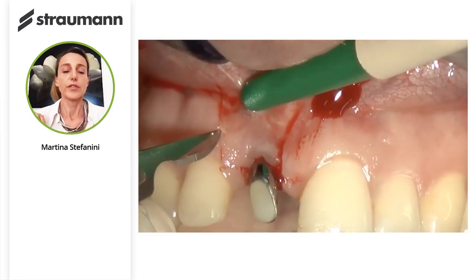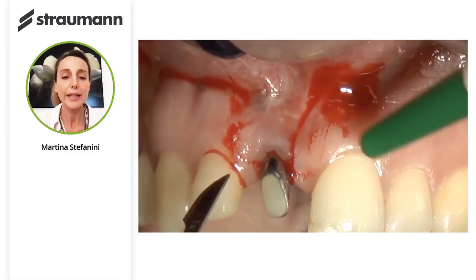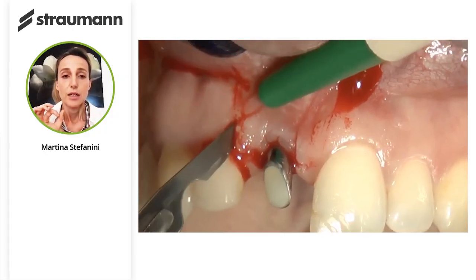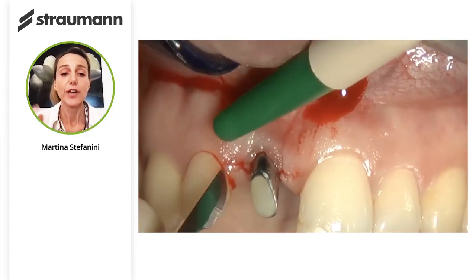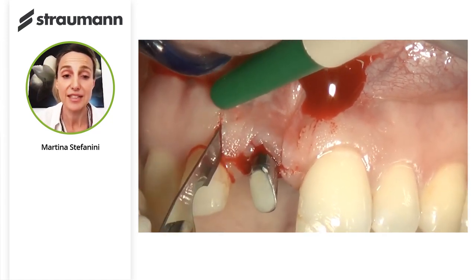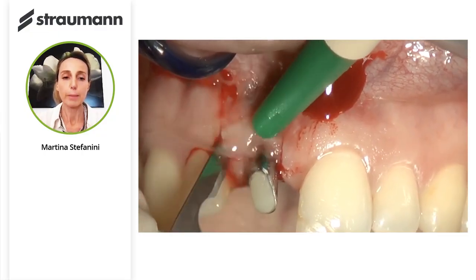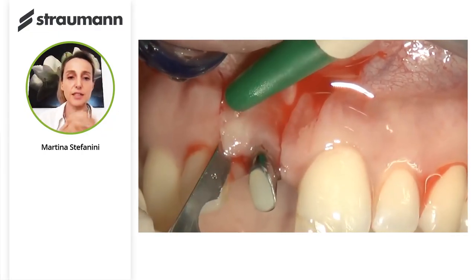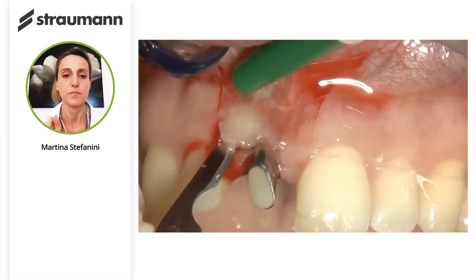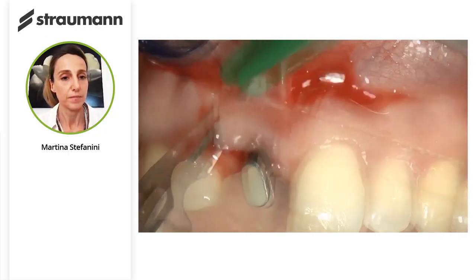The surgical procedure starts after the flap design with the split thickness surgical papilla elevation. The surgical papilla should be elevated split thickness, keeping the blade parallel to the external tissues, trying to elevate the papilla with a uniform thickness in the entire body of the papilla, not too thin, and as uniform as possible.